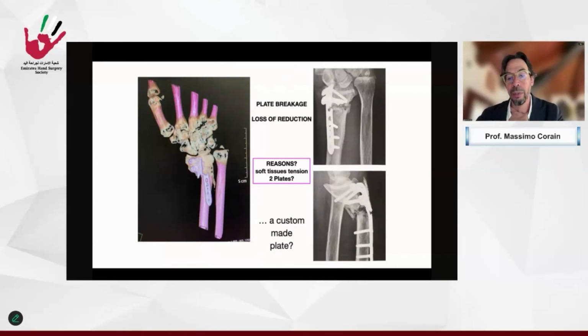This is because of the soft tissue tension that we often have during malunion. So we have to consider this, and I ask you to remember this case when we see the next cases at the end with the PSI.